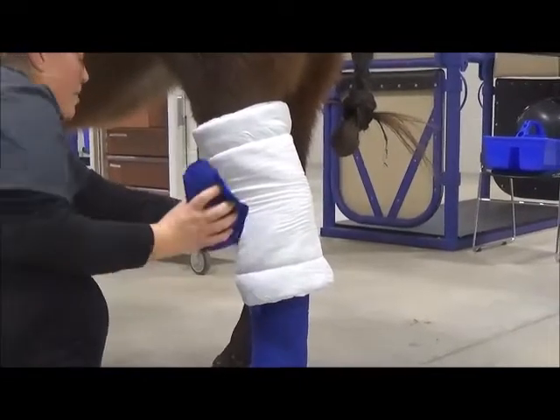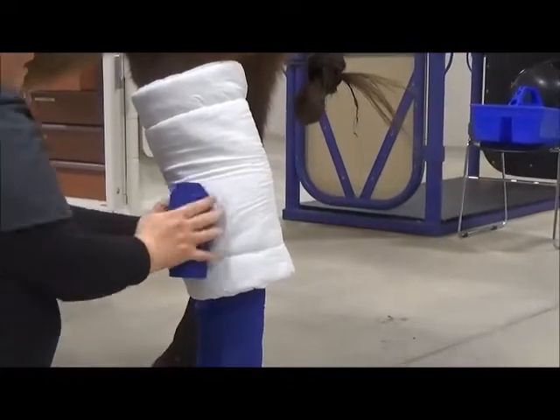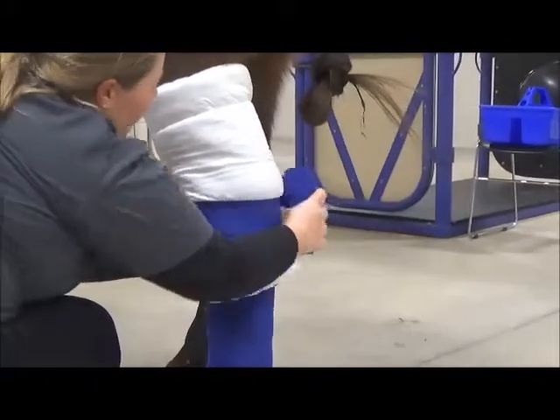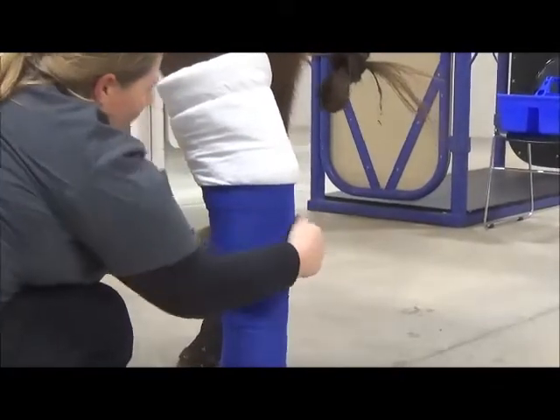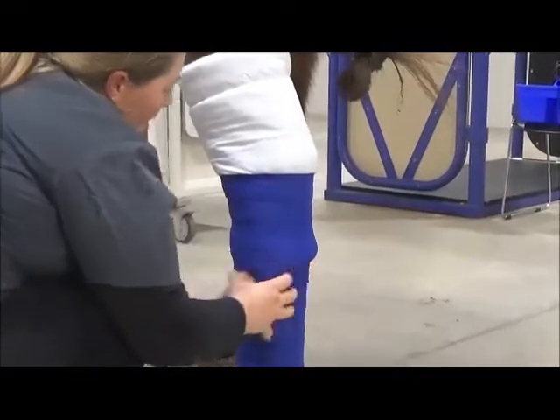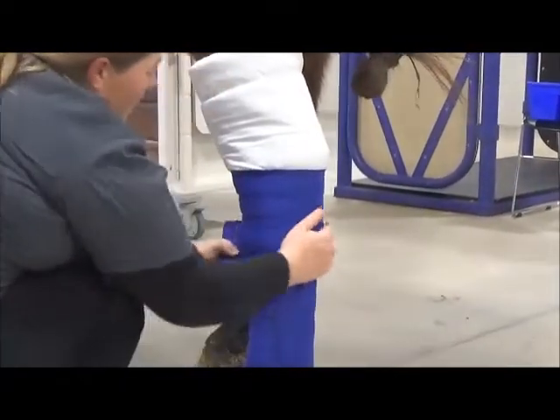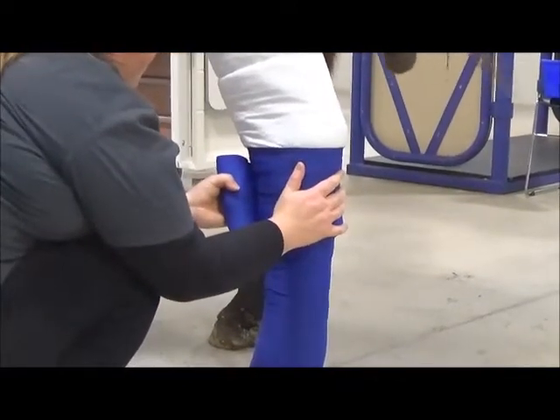with the bandage part, you're going to do a figure 8 pattern. So I always start and get the distal part of my wrap nice and secure. And I also wrap down onto my wrap below. So just one continuous wrap. And then I start my way back up.